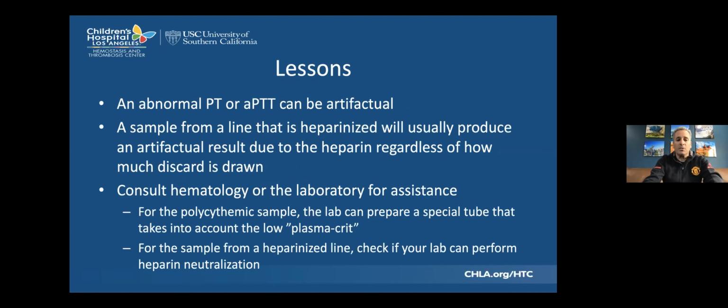So what are some lessons here? An abnormal PT or PTT can be artifactual. A sample from a line that is heparinized will often produce an artifactual result due to the heparin, regardless of how much discard is drawn. I had this recent situation in the neonatal intensive care unit where they just kept drawing more and more discard, and no matter how much they drew, it didn't really matter.